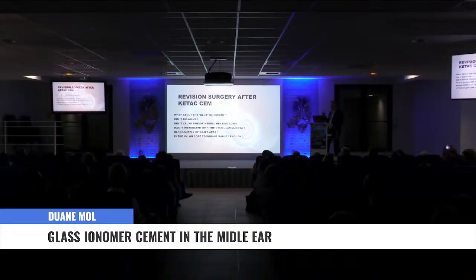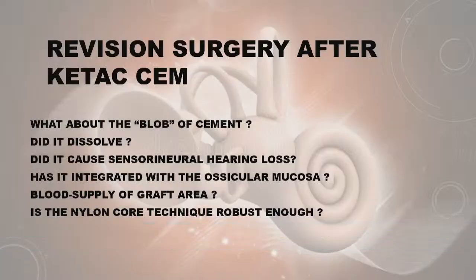Does it dissolve? That's where those three years in the beginning came in. We tested it, we unofficially put cement in ears, reconstructed it, and we had to really believe that this works. Belief doesn't change the fact that it does or does not, but we had to prove to ourselves that it worked. In 2009, I was sufficiently convinced, as we had not had any breakdowns, that I could now continue to use it.